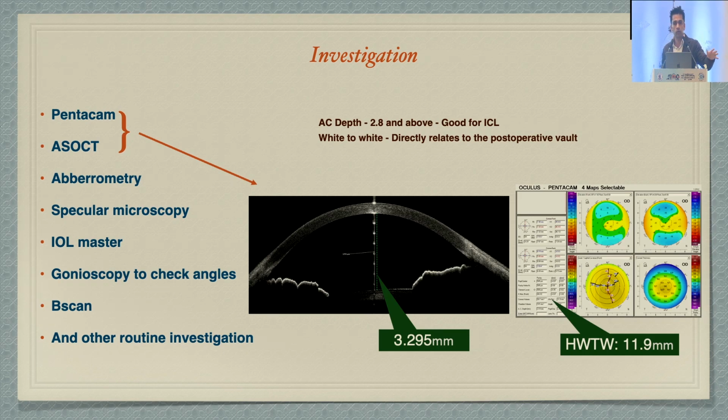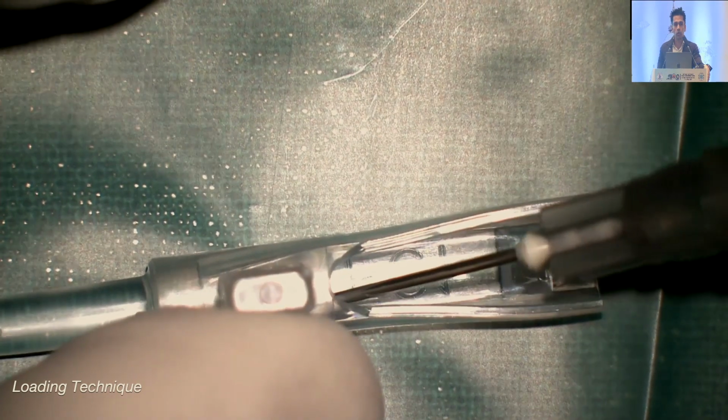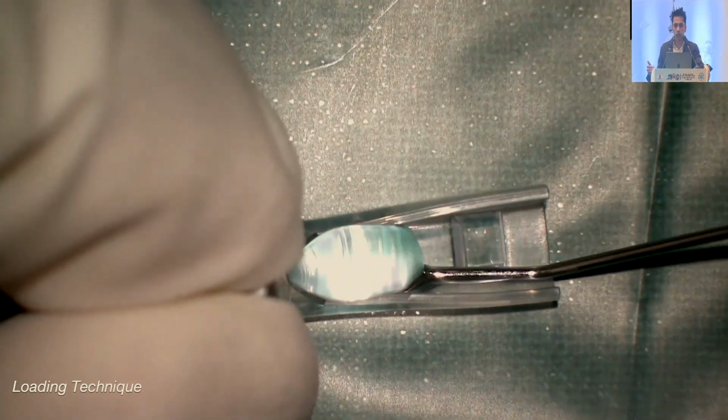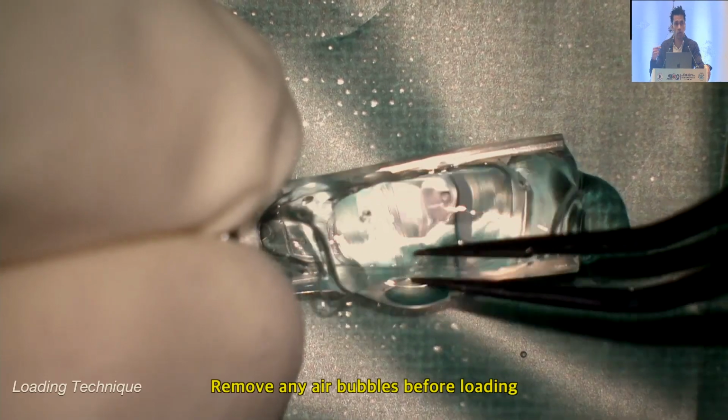If your diagnosis is right, your ICL pretty much goes rather smoothly, except if you have an intraoperative issue, which I'll come to. In intraoperative issue, the first step is loading. Don't allow the loading to happen by someone else. Do the loading yourself. Ensure that there are no air bubbles in this viscoelastic injection in the cartridge.